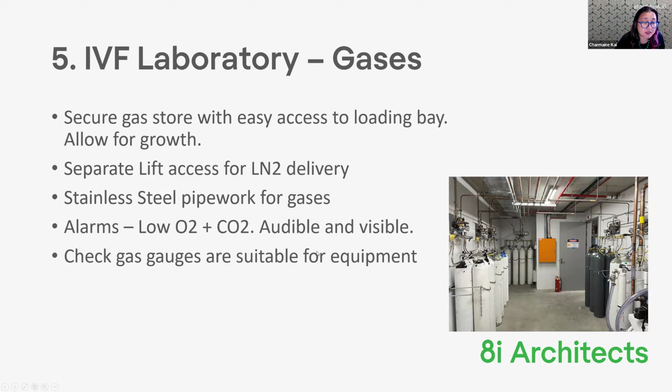The use of stainless steel pipework for your gases, that's what we're trying to aim to do. And again, it's something you should let your engineers know. Otherwise, they'll end up using copper pipes, which isn't as good. We've got some issues with that.